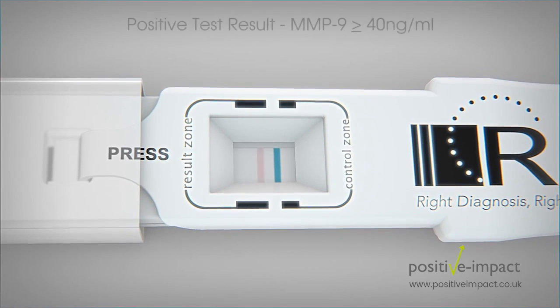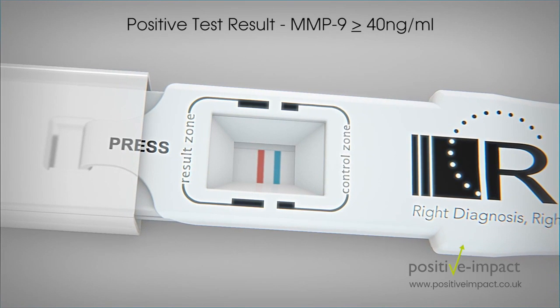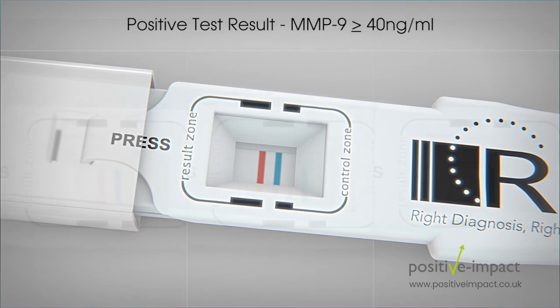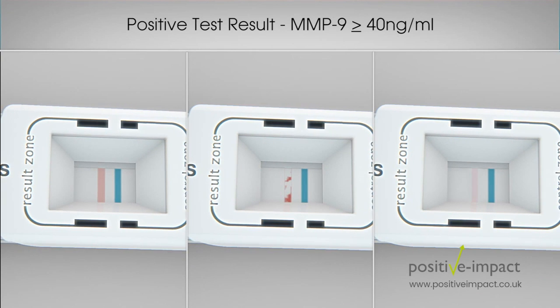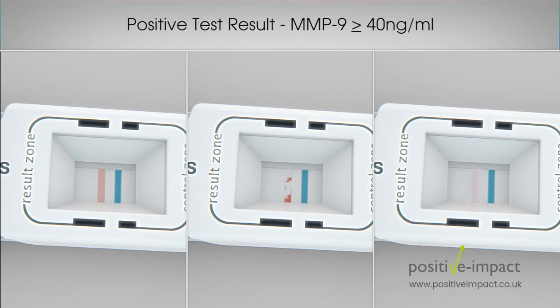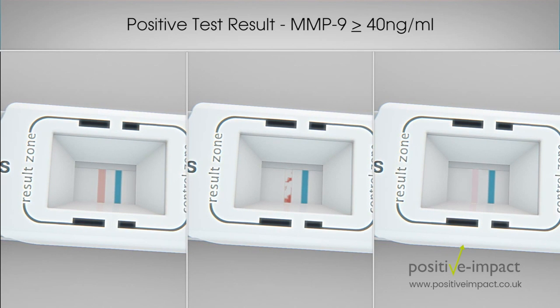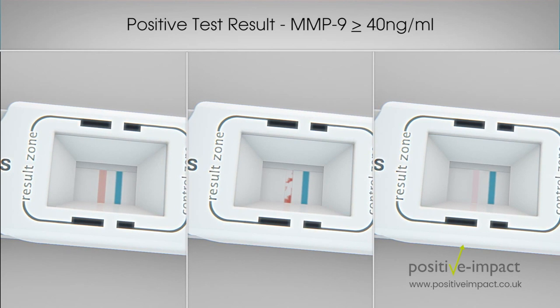interpretation. The presence of both a blue line in the control zone and a red line in the result zone indicates a positive result. Any form of a red line, whether faint, broken, or shadow, is indicative of a positive test result. A positive result indicates the presence of matrix metalloproteinase 9 in tear fluid is greater than or equal to 40 nanograms per milliliter.